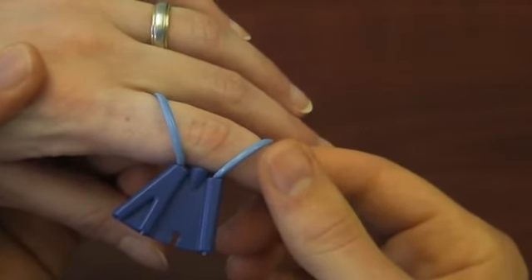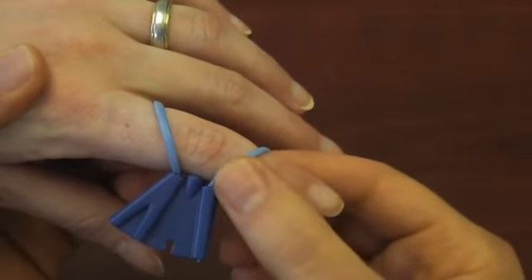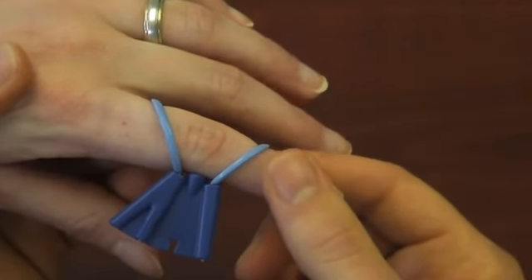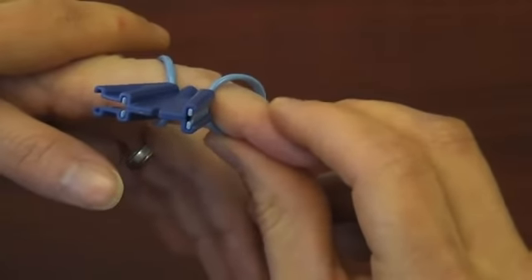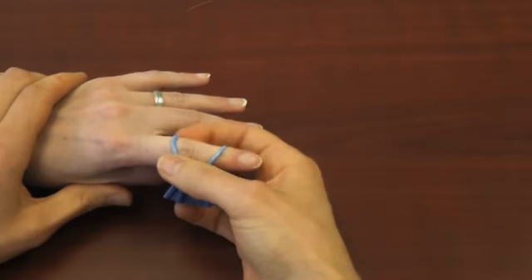To determine if the rings are too loose, keep the finger straight and lightly press on the edge of the splint. If you see a lot of gapping between the finger and the ring, then the size may be too big, and you may want to try a smaller size.